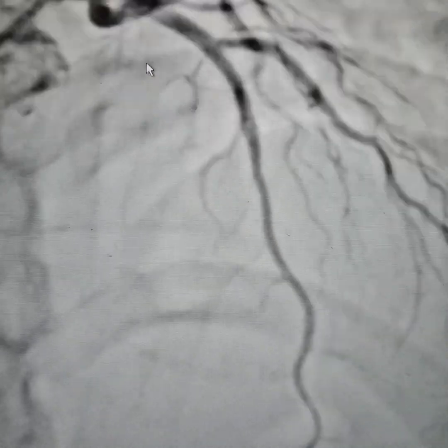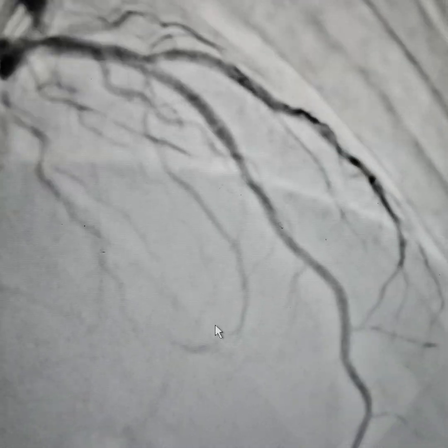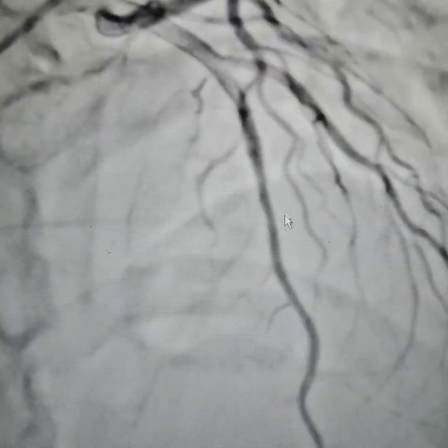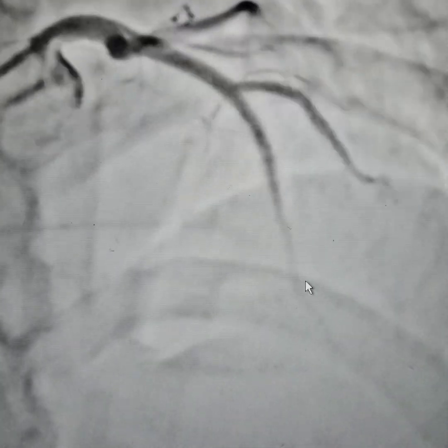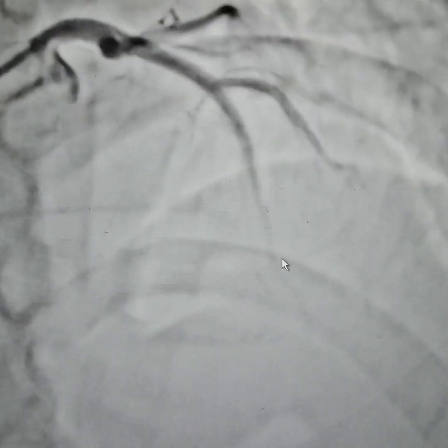We did not stent the distal segment — we only stented the proximal segment. You can see very clearly that this segment has opened up. Sometimes when there is a chronic total occlusion, you get findings like this, so you just have to give some nitrates and be patient. Stenting is easy, but stenting unnecessarily is to be avoided. Overall, a very good result.